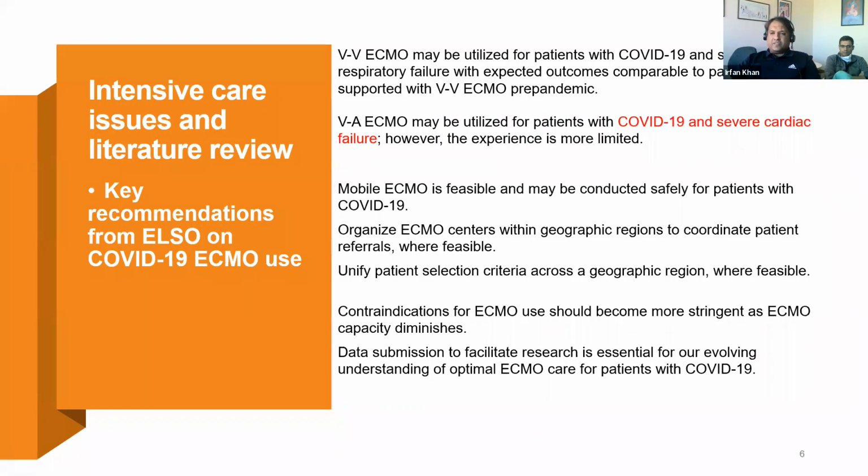So what are the recommendations from ELSO on the intensive care issues? First of all, ELSO has determined that VV ECMO may be utilized for these patients with severe respiratory failure. Again, their outcomes are essentially comparable to pre-pandemic VV ECMO outcomes in ARDS. The other recommendation: VA ECMO also can be utilized in patients with severe cardiac failure. However, the studies and the experience with this are quite limited.